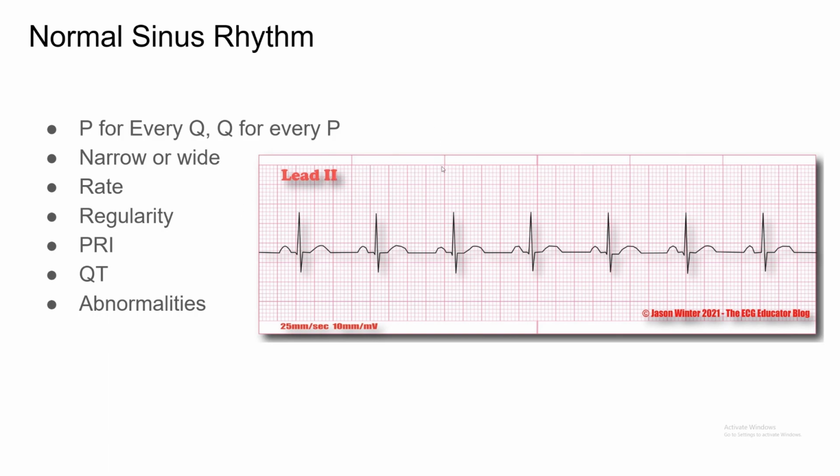Let's take a look at ST segment elevation, right? So I have this upward deflecting QRS. So this would be ST segment elevation. If this S wave, instead of going down when it's hyperpolarizing, cardiac myocyte, it would go, bam, right there, into this T wave. That would be ST segment elevation, and the specific criteria we're looking at for ST segment elevation would be 1 millimeter, right?